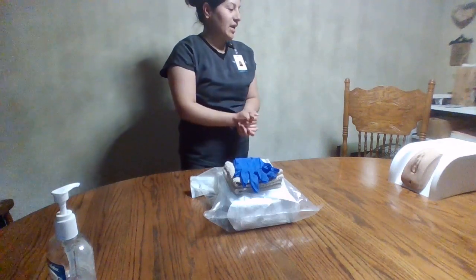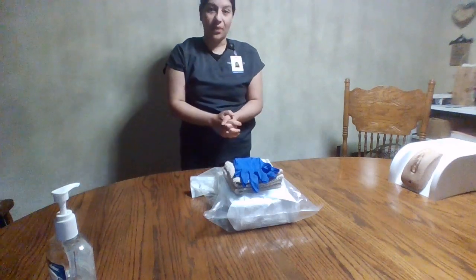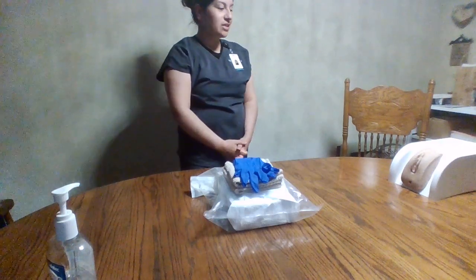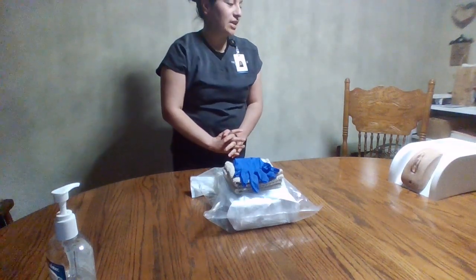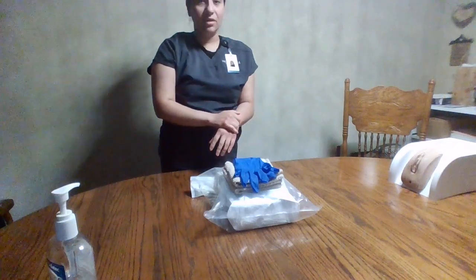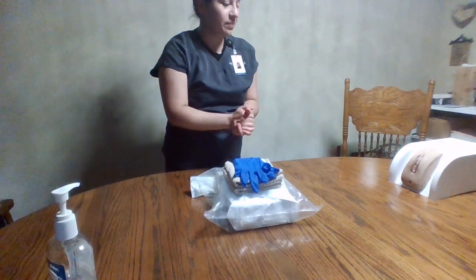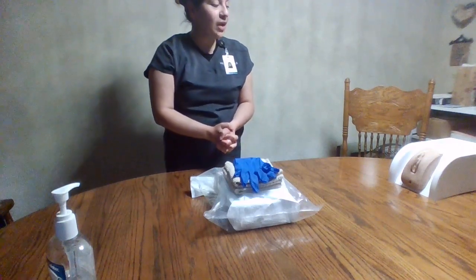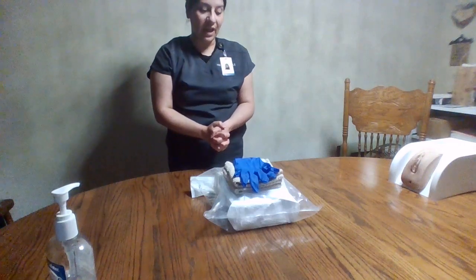Hi, my name is Desiree, and I will be your nurse today. I will also go ahead and verify I have the correct patient using two patient identifiers. If I can please verify your first and last name as well as date of birth, please. Okay. And I will go ahead and confirm I have the correct patient along with their wristband. Once I have verified that I do have the correct patient, I will go ahead and inform the patient of the procedure that we will perform today.